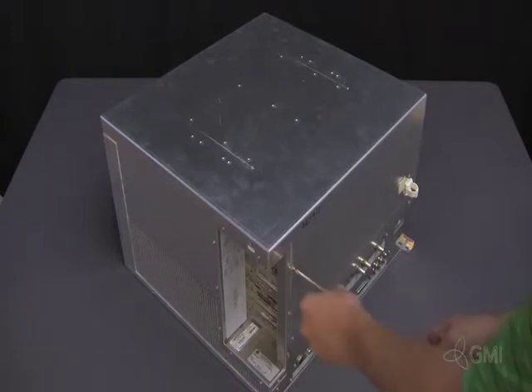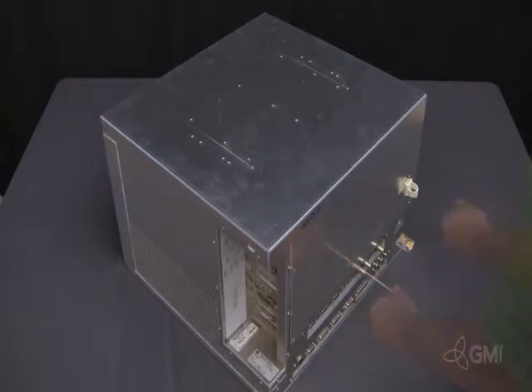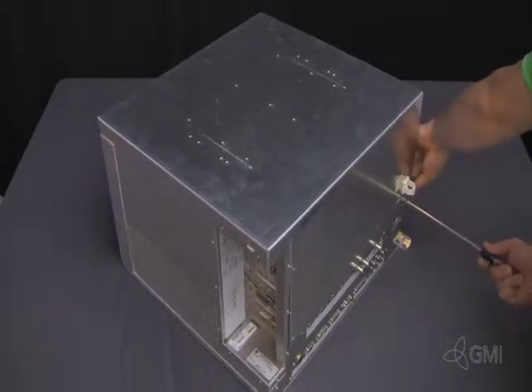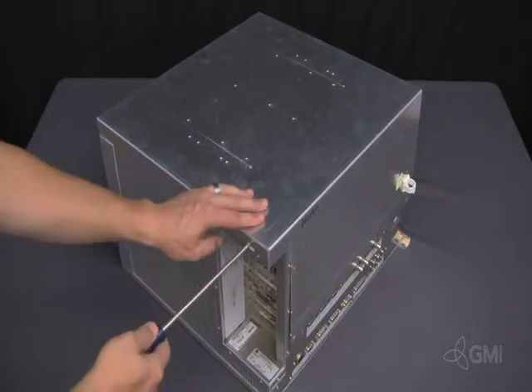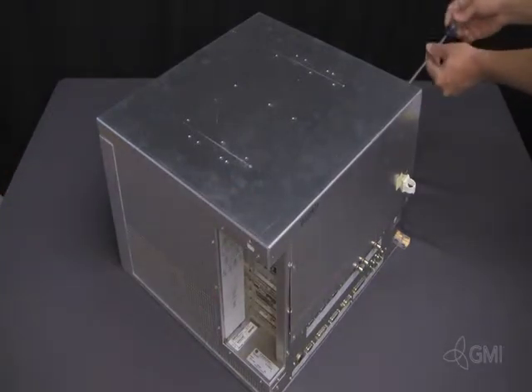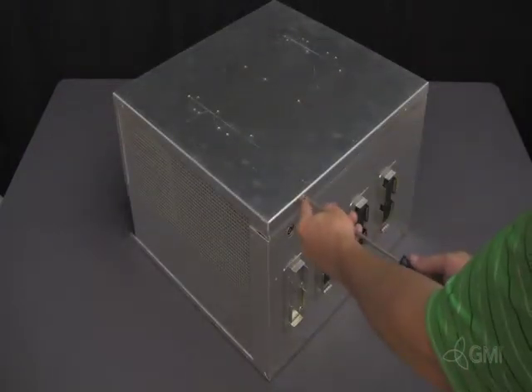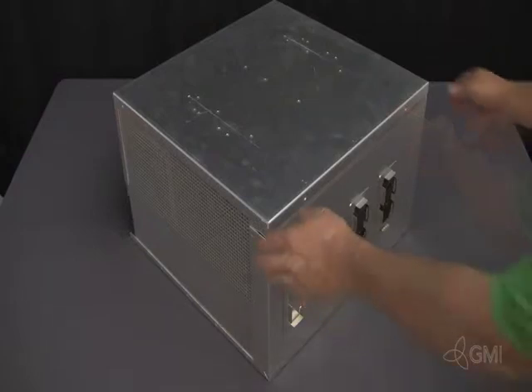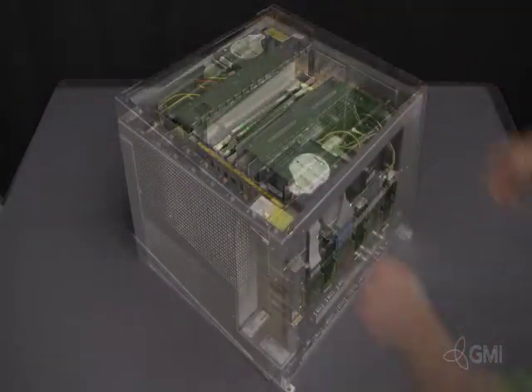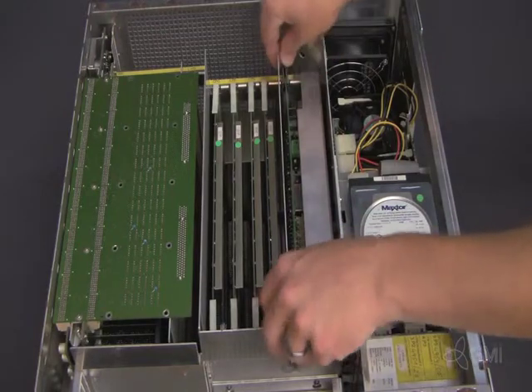Remove all screws securing the e-box cover — 8 in total. Remove the e-box cover by lifting up. Remove the CPP cover by pulling up from both sides. Use the ejector tabs to pull up and remove the CPP.